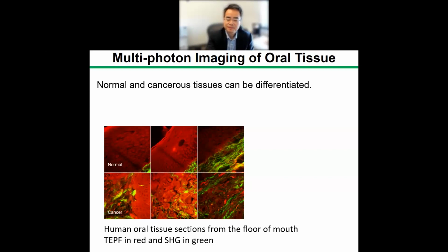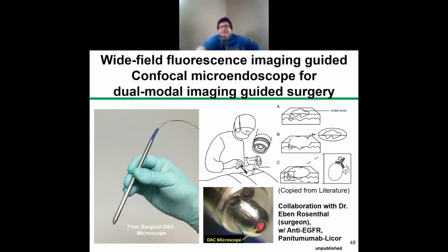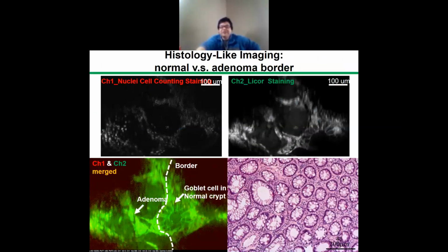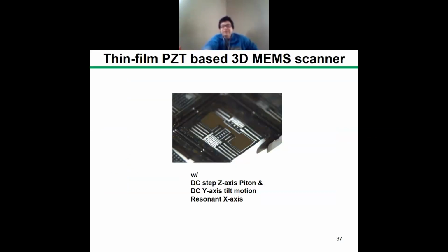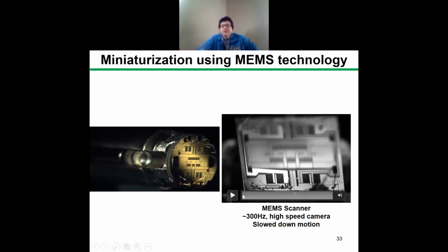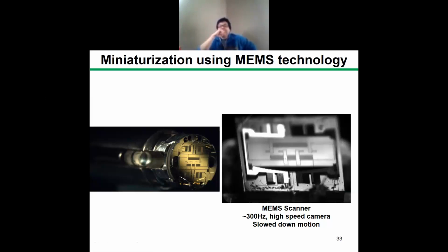Yeah, so one of the differences, for example, first of all, making a MEMS scanner is challenging because it needs a lot of facilities. But the good thing is, in Michigan, we have a very good foundry located in Ann Arbor. And also, we used to work in Argonne and also the Stanford facilities. For example, this scanner is the only one in the field that can travel so large in Z using an electrostatic way.